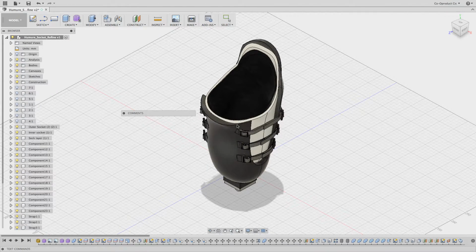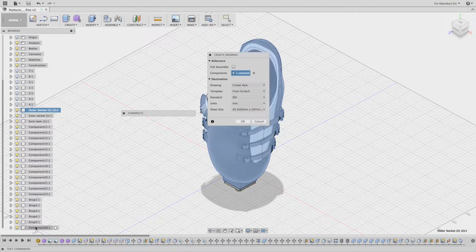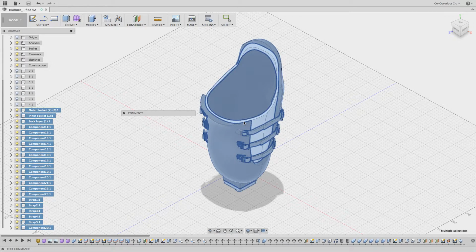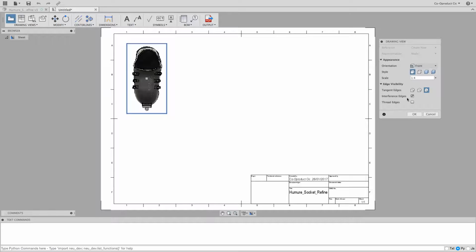I need to click OK to save my changes, and in the dialog window, I'll uncheck Full Assembly and select the components that I need. In the browser, I want to hold down the Shift button and select all of these components. And when I've done that, I can click OK to launch the drawing sheet. In the drawing workspace, the first thing I need to do is place my base view. I want to make my view slightly larger, so in the dialog window, I'll enter 1:4 for the scale. Then I click to place my view here, and click OK to close the window.